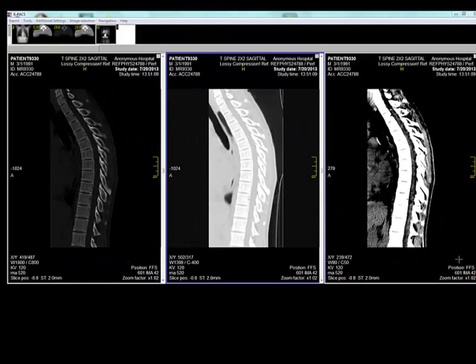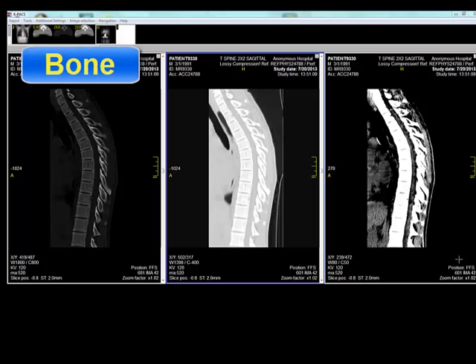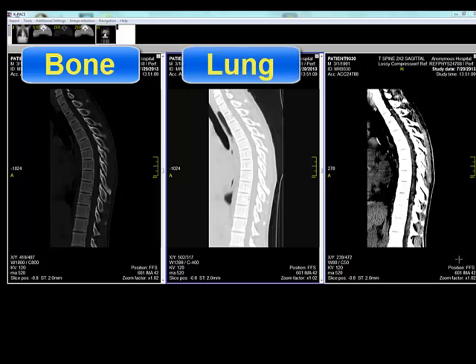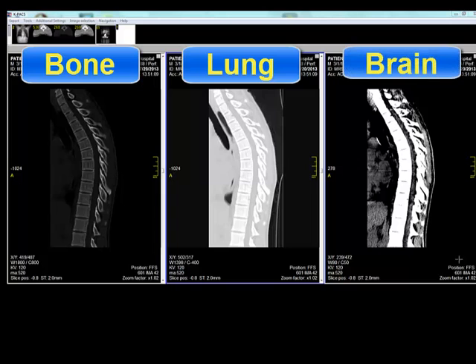A different windowing was used in each of the three tile screens. In the first tile screen to the left the windowing was set to bone. In the second tile screen the windowing was set for lung. And in the third tile screen the windowing was set for brain.